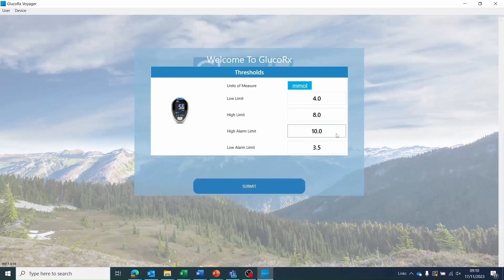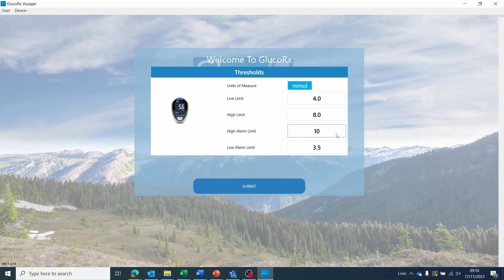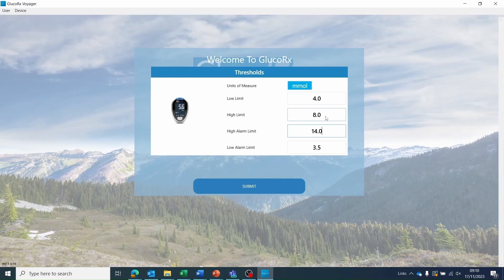You will be prompted to input your target low and high glucose limits. This is only required when you first log in. This is personal to each user. If you are unsure what your blood glucose limits are, then please speak with your healthcare professional.